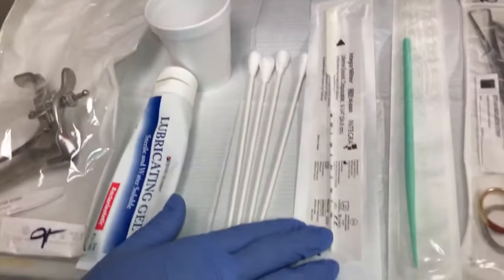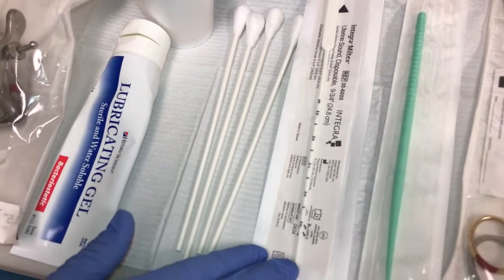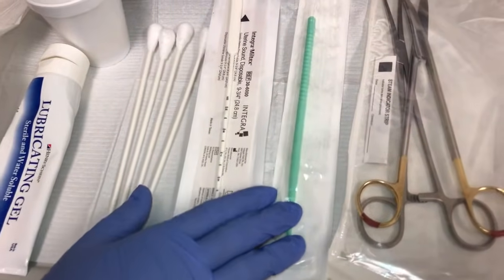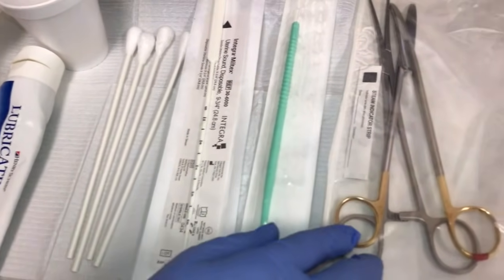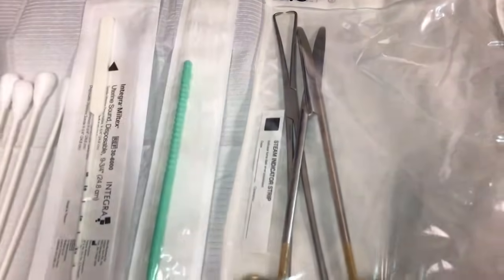We have the uterine sound, which measures the fundus and gives the provider an idea of where the IUD needs to go. We also have the dilator, and then here we have the scissors and the teneculum.